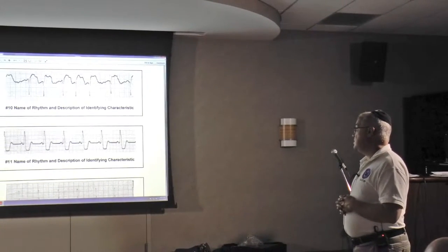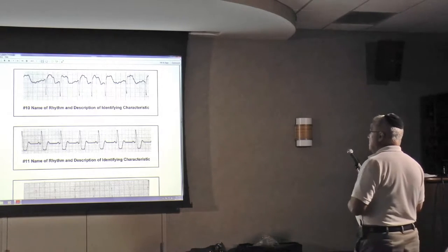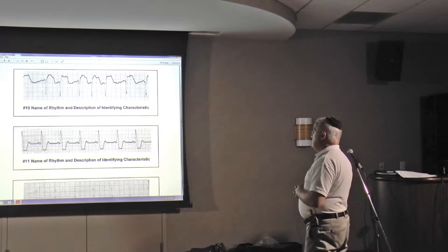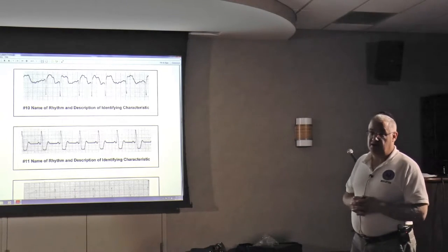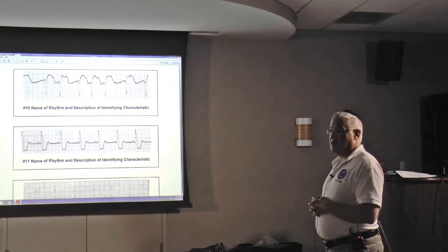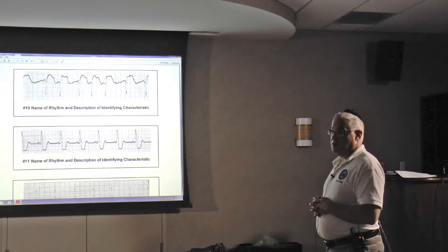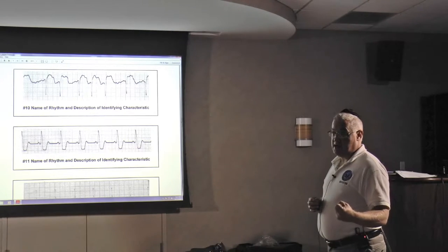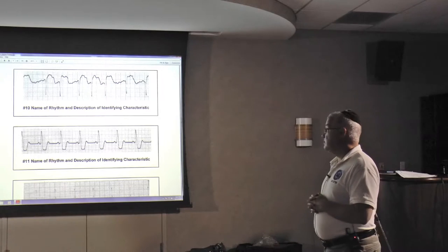So that's what this is. It's atrial fibrillation with possibly some, again, we're only looking at it in one lead, but possibly some ST elevation. So if this guy was saying to you, I feel like my heart's beating irregularly and I have chest pain or abdominal discomfort, it would probably be a good story for somebody who maybe went into a new-onset AFib, secondary to maybe having a heart attack, or maybe he's just having chest pain because they're in new-onset AFib.